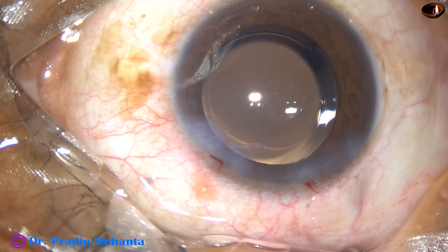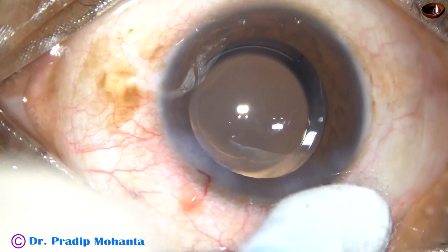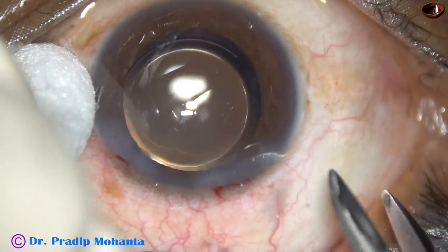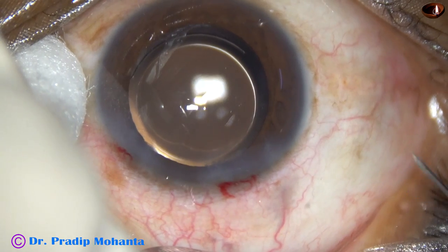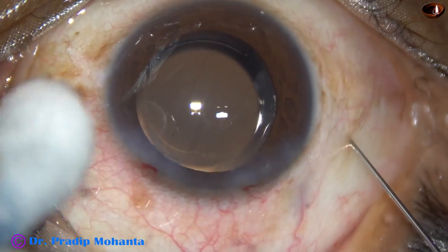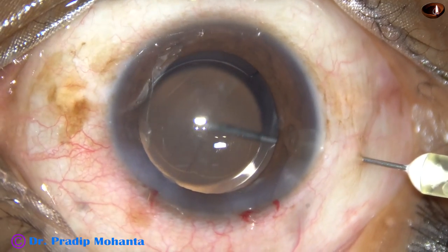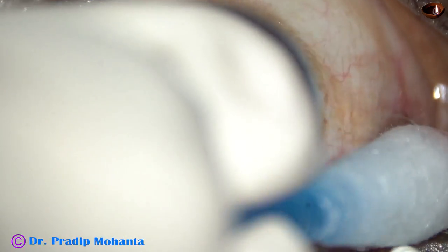Now, injection of anti-VEGF. In this case we are using Bevacizumab 0.06 ml. This is placed about 3.5 millimeters from the limbus.